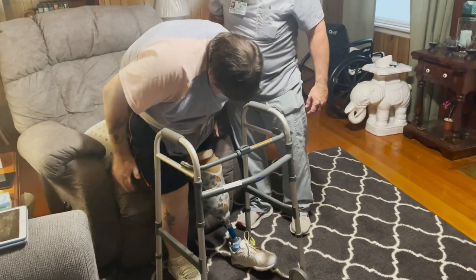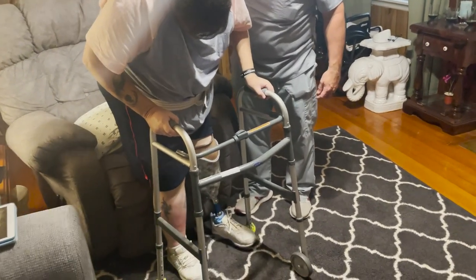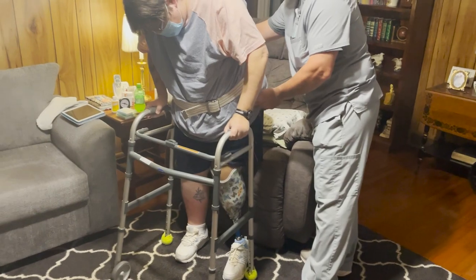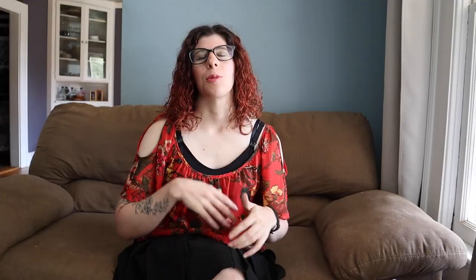This was actually the first time me seeing her up on the prosthesis since we delivered it several months ago. Unfortunately, right when I was about to deliver, the patient had a fall and had a tibial plateau fracture. So we were waiting for that to heal, and then a car accident happened and her residual limb collided with the dashboard. The limb has healed, but still very sore — but she did do awesome today.